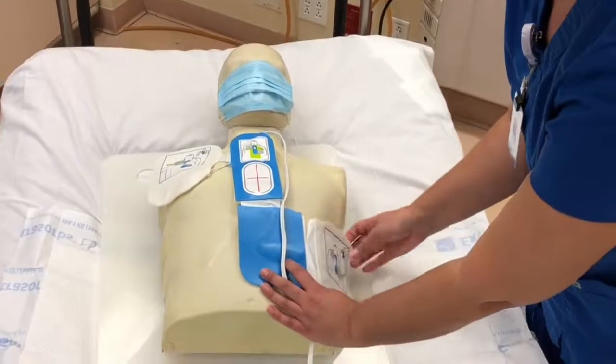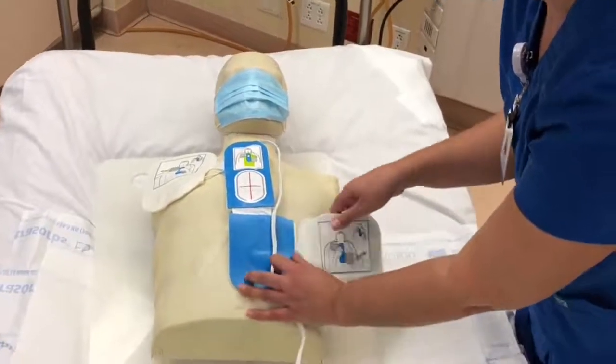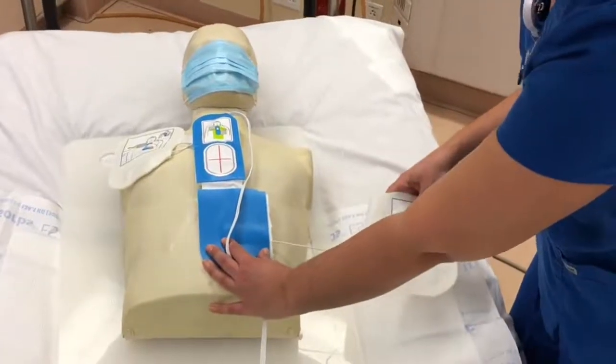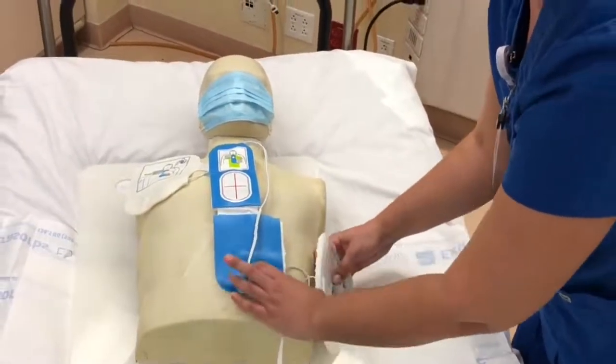This is what the pads look like when they're properly positioned. If you have a patient with a larger body habitus, pull down on the pad and you can extend it out to be able to fit the patient and properly connect.